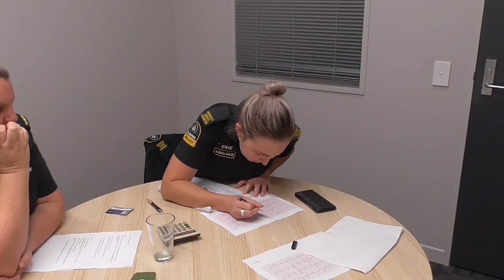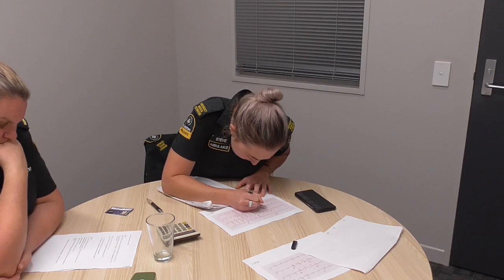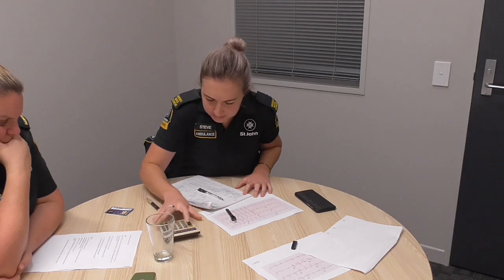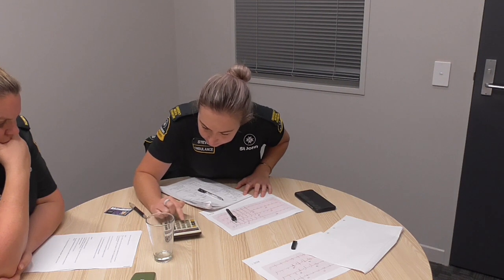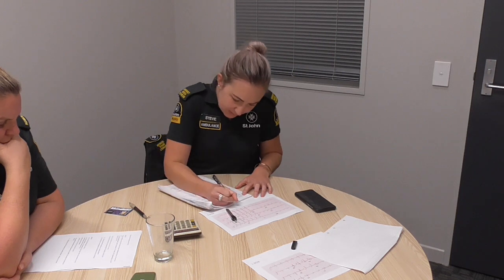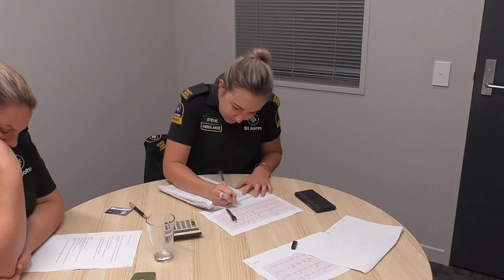So just counting small boxes between the R waves and then going to divide 1500 by that. It could be 17 or 18, I'll just go 17. That equals 88, so that's our rate of 88, regular.